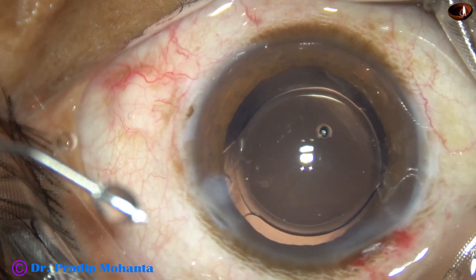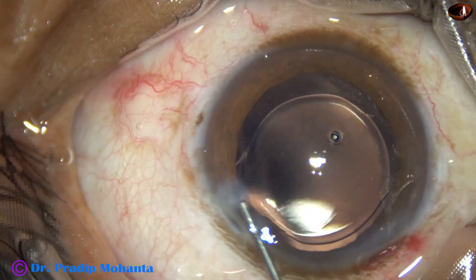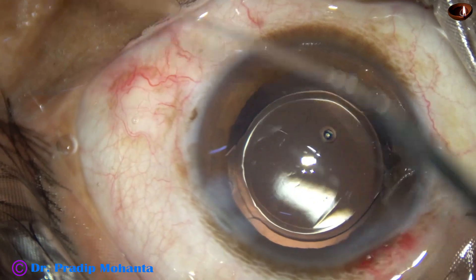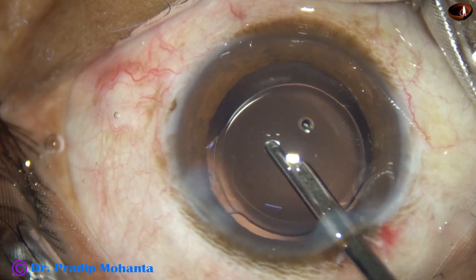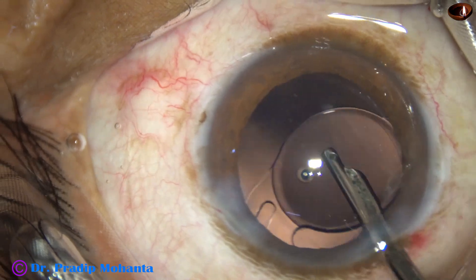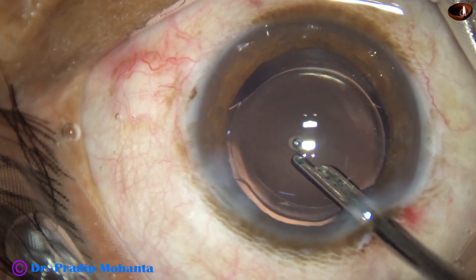The side port is closed by hydrating the corneal stroma with BSS. The main wound has been constructed in such a way that it does not require any hydration. Now this is the final lavage of the anterior chamber with BSS.